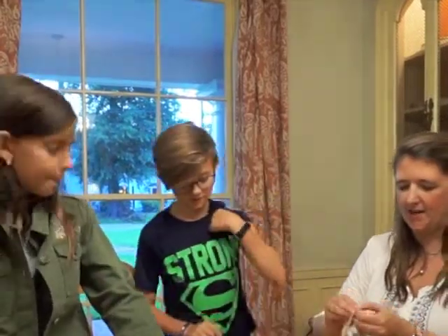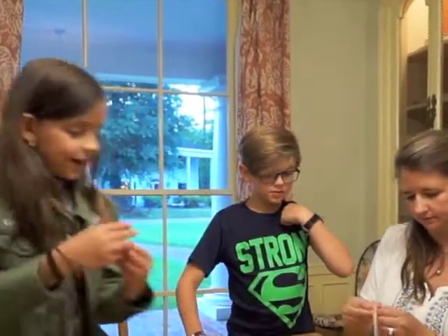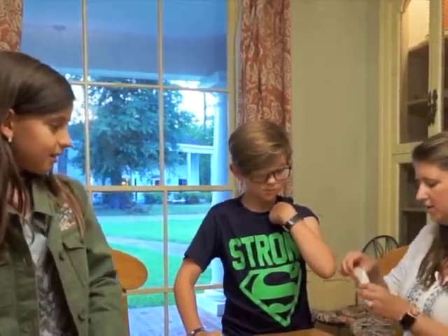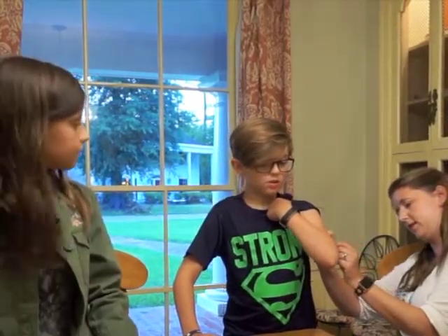Now it's kind of dry enough to where we can put the sugar patch on — put the hot dog on. I popped that little thing out and showed you where the hole is. Hugh loves to eat, so anything related to food he just gobbles down — and he likes to wear it on his arm.